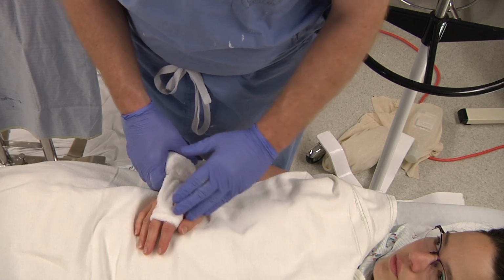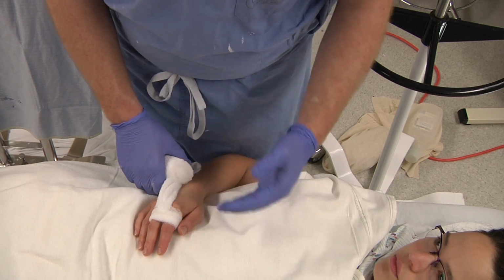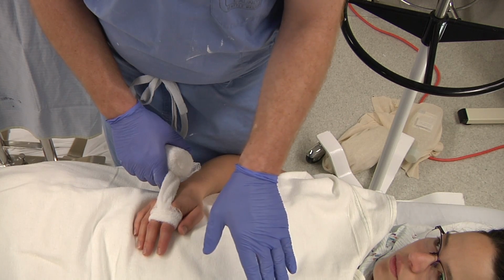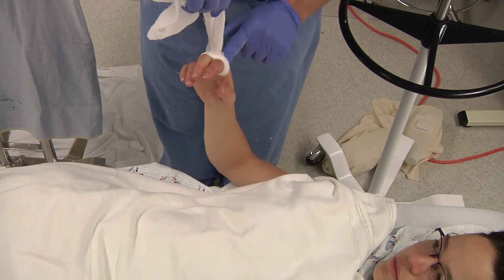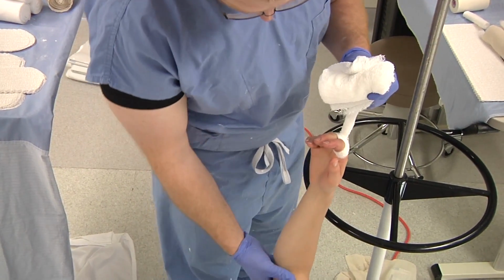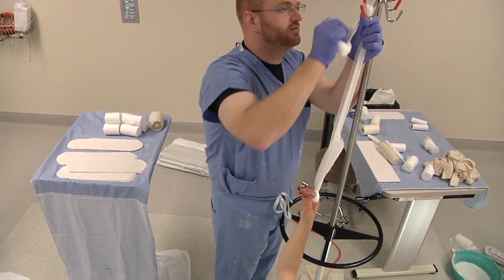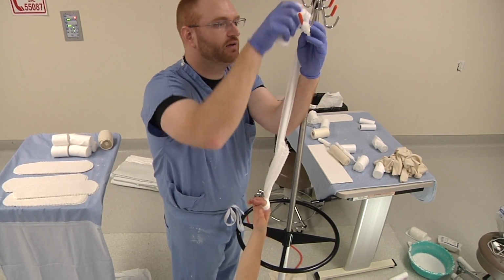You need to not leave your patient hanging in traction, especially if they are compromised in their ability to say if there's too much pain or if they're having numbness or tingling in these fingers. From there then, generally we do the index and the middle fingers to get some ulnar deviation, a slight amount of flexion at the wrist. You can take the arm and with that little cinch knot there, abduct their arm to make it easier for yourself and suspend their fingers from an IV pole, sometimes the overhead lights. Make sure that this is very secure at the top by wrapping it around itself a million times or tying a knot.